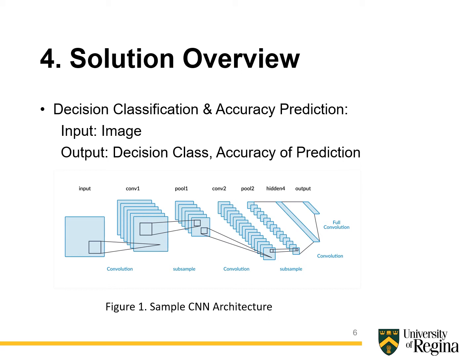The final output of the convolutional neural network architecture are the image classes and the respective accuracy of classifying an image to the respective class. The class corresponding to the top accuracy is preferred for the decision.